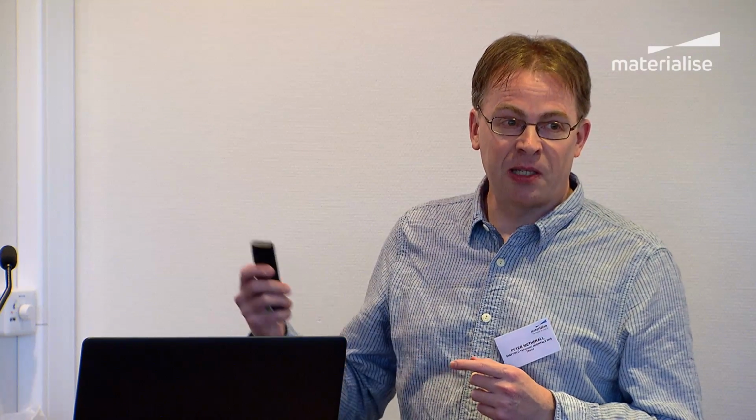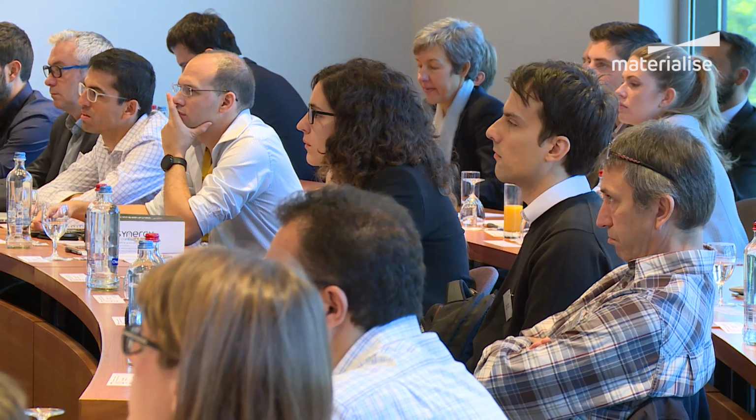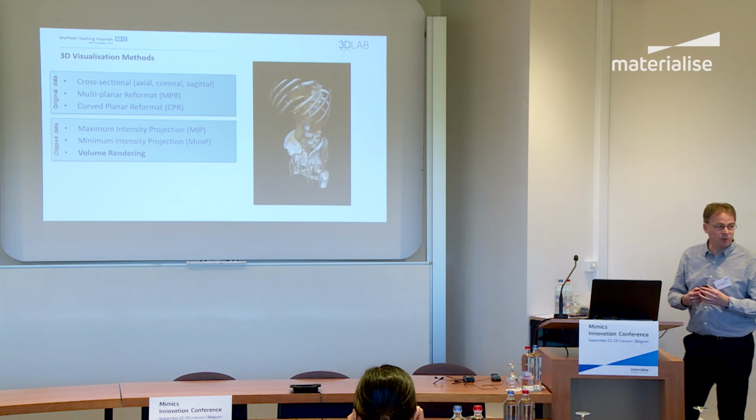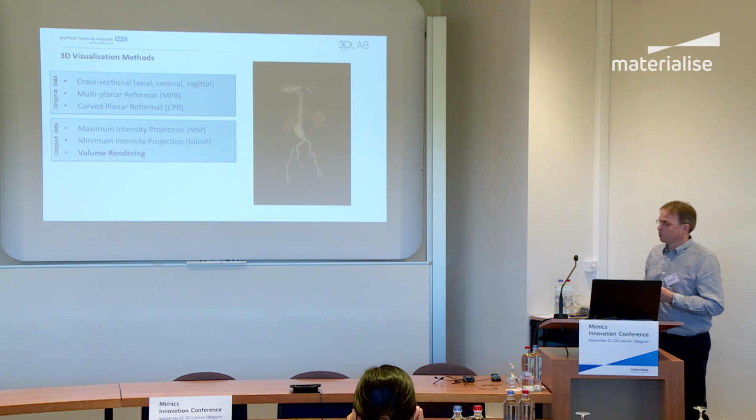But what tends to happen in most radiology departments is a cine, such as this, is sent to PACS for the referring clinician to view. But that's all they can do with it. They can play and stop that movie. They can't interact with it in any other way. And for surgical applications, it's important that the surgeon can fully interact with the images to get a true understanding of the anatomy.